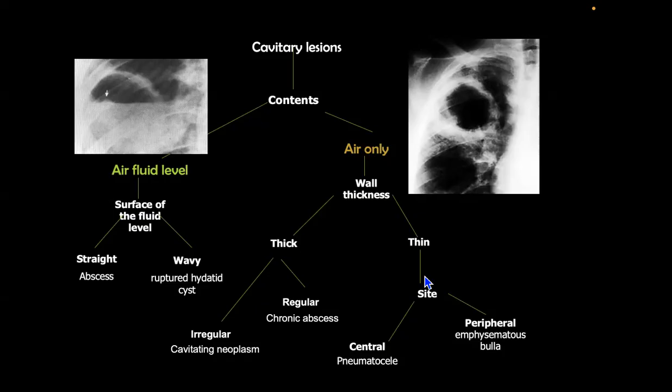Even this has interpretation which is somewhat incomplete and difficult. Nowadays, we are talking about the ultrasound for the ICU, what we call the FAST scan. We train the residents in the ICU and the emergency residents on that, and they do it very efficiently. And it gives us diagnosis for many conditions.